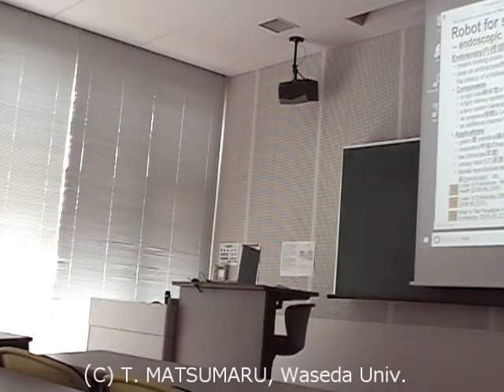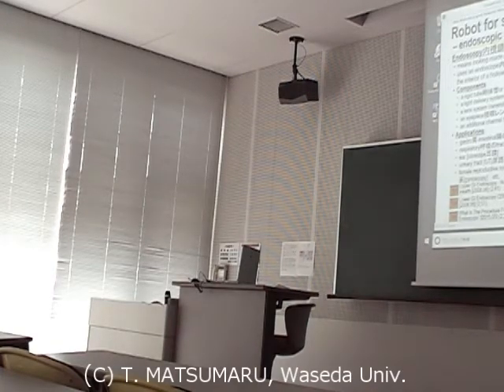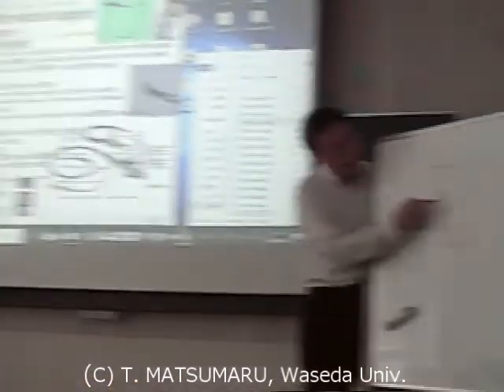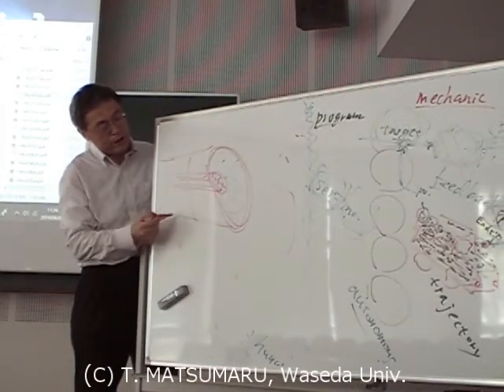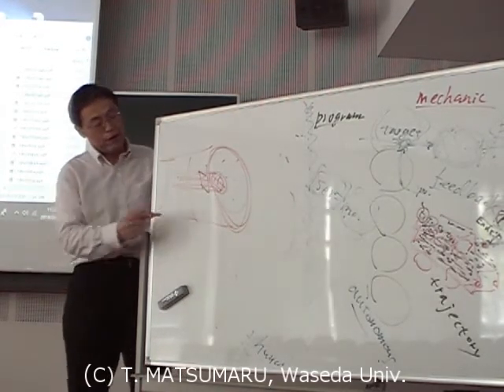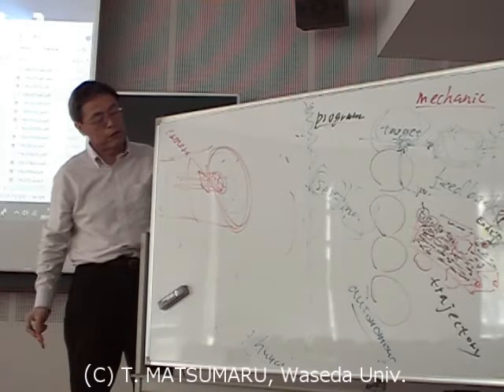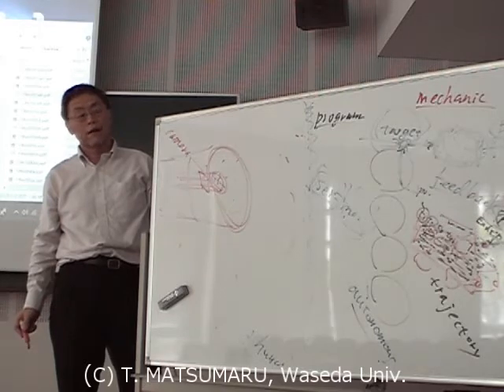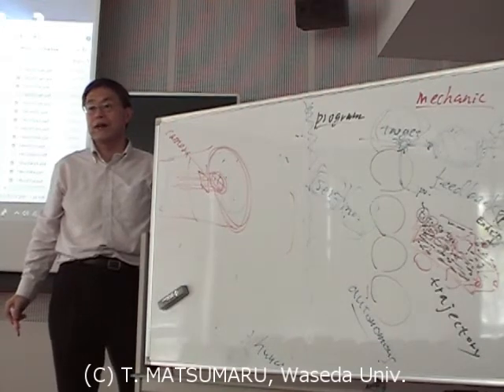There's a hole here. What kind of hole is necessary to do some task? Well, a camera. At first it was a fiberscope with optical fiber, but presently it is only a lens and a CCD chip. This is one camera hole. And, is the camera alone enough that it can watch inside of the body?